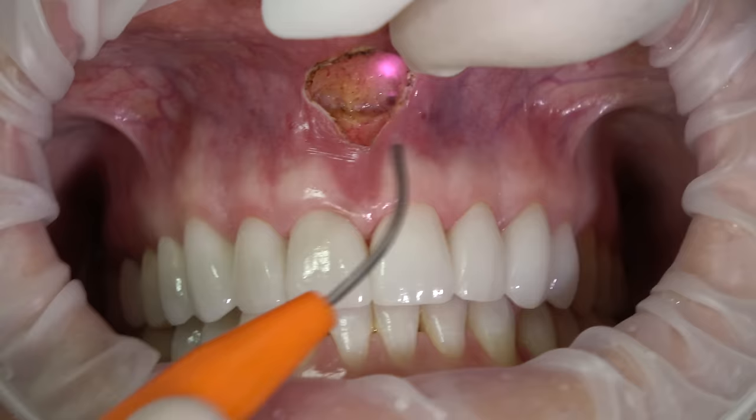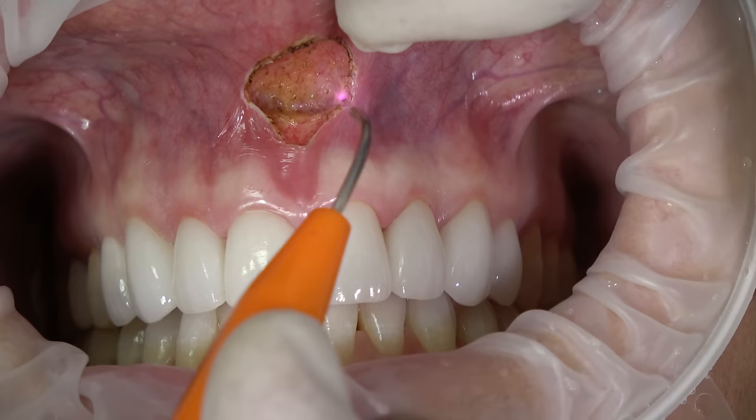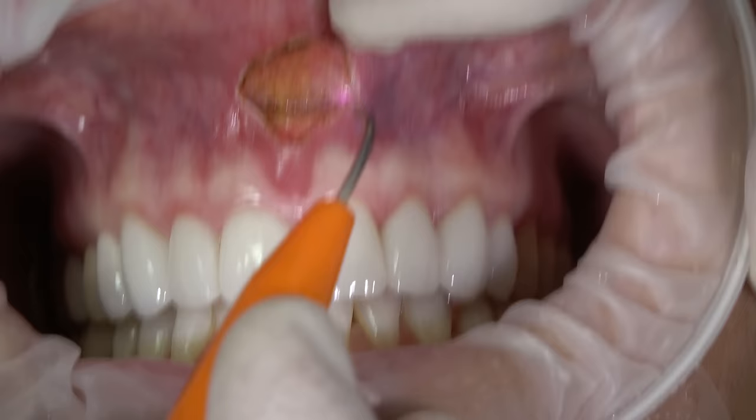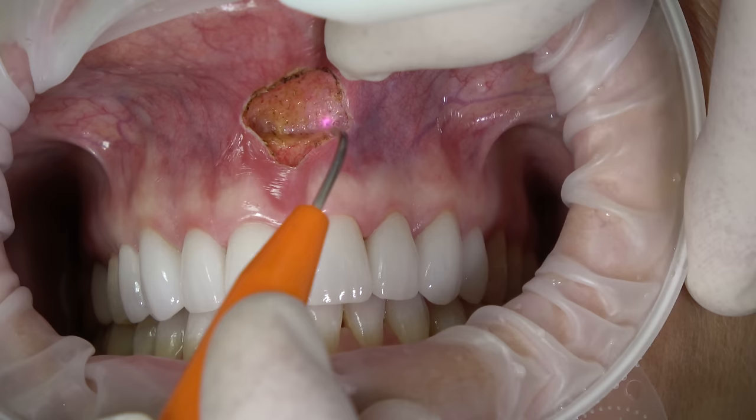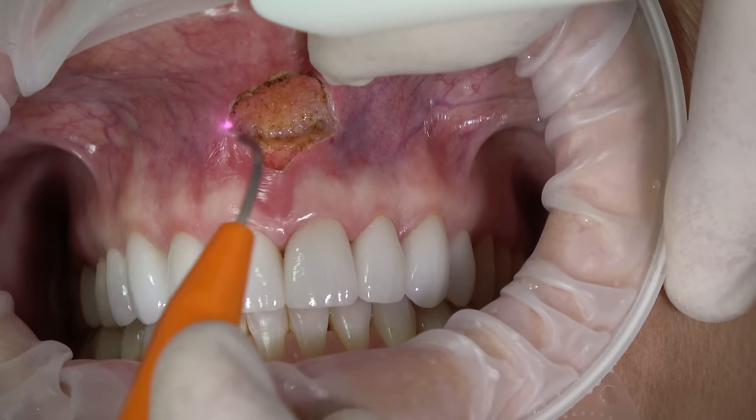What I'm doing is just cleaning up these borders, going a little bit more laterally. You can see we still don't have any bleeding, hardly any laser char.